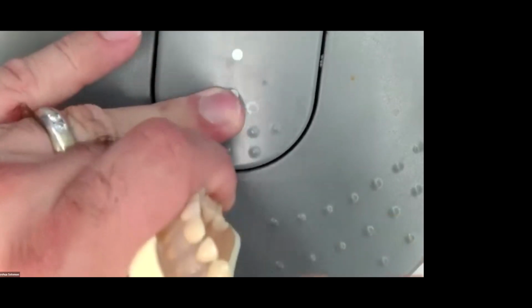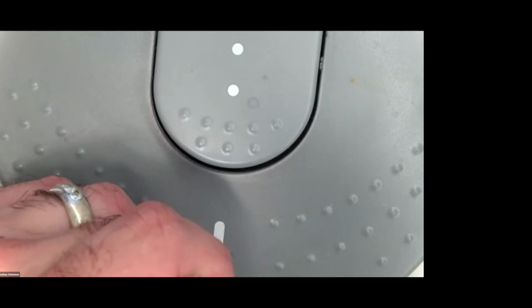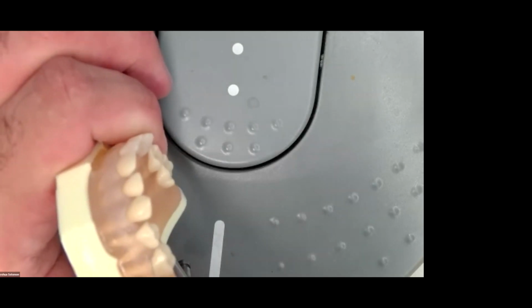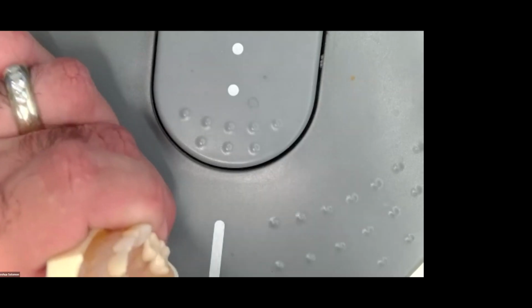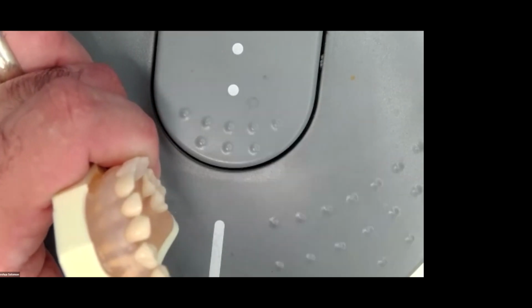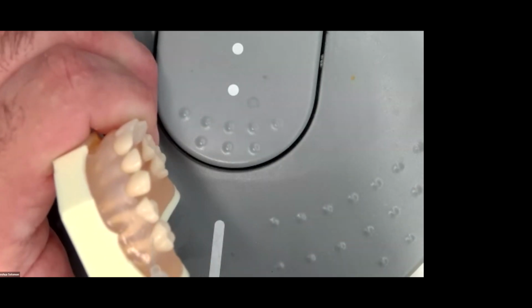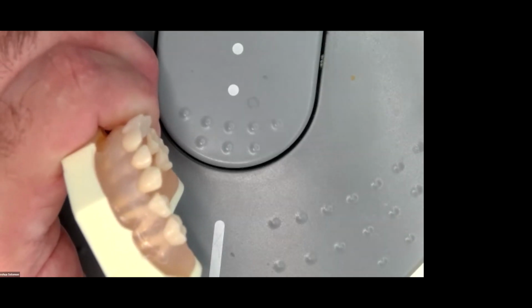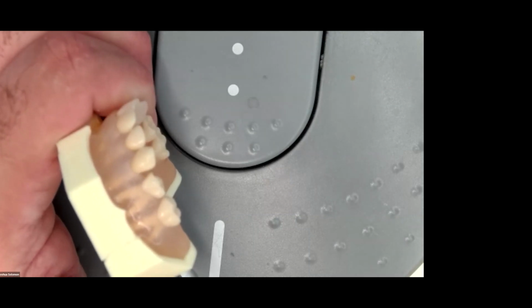So small pedal is for that stage 1, just for the papilla. And then once you have your manual bone penetration, then you're on the big pedal. Some people have asked previously about why don't we just use the big pedal for everything? The reason being is, remember, there's a ramp up here. So if you use the big pedal for stage 1, it's going to start delivering the local anesthetic faster and faster. You don't want to over deliver here in that first stage, because if you do, you run the risk of having too much local here and having a numb lip afterwards. That's the number one reason why I found where docs are having an issue with numb lips after that first day, or actually with the injection whatsoever.